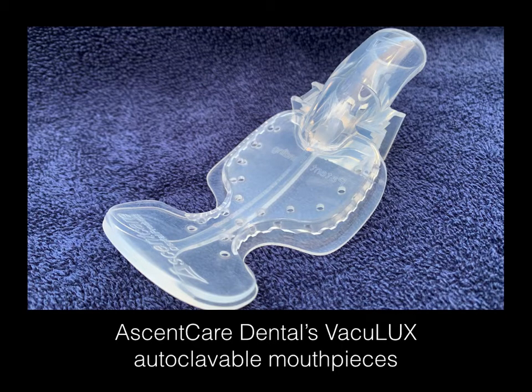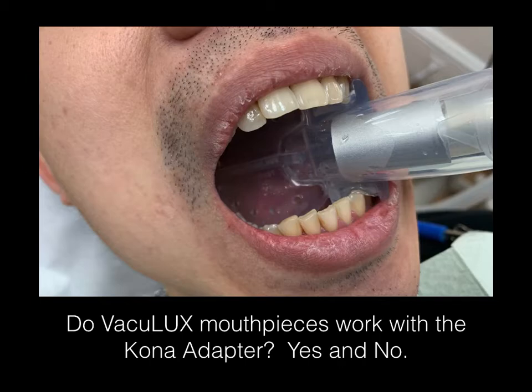This is Ascent Care Dental's new VacuLux autoclavable mouthpieces. They just came out last year, and a common question I get is: do the VacuLux mouthpieces work with the Kona adapter? The answer is yes and no, and I'll explain.